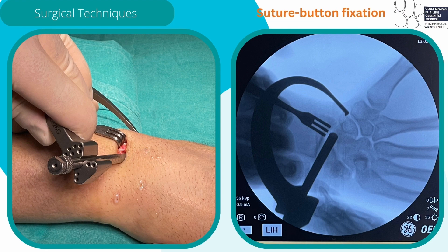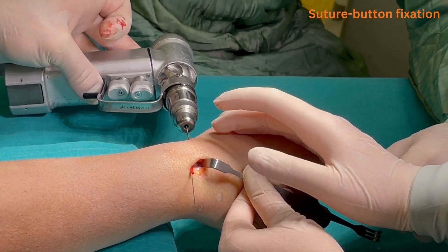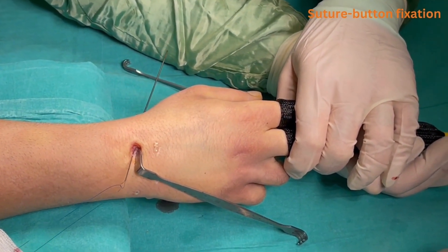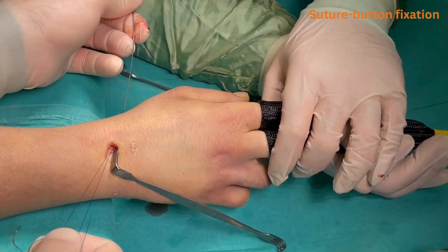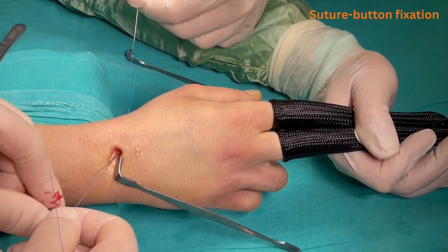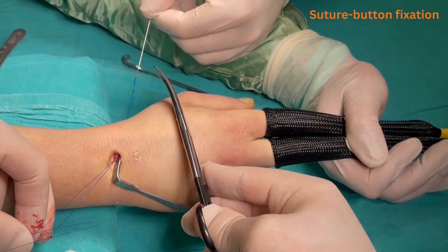If available, the direction of the guide wire can be determined with a jig system. The guide wire is pulled back slightly from the distal exit side. The prolene suture is passed through the K-wire's nitinol loop and the guide wire's opposite end is pulled, bringing the suture completely through and exiting at the distal pole of the scaphoid. The nitinol loop of the K-wire is then cut.